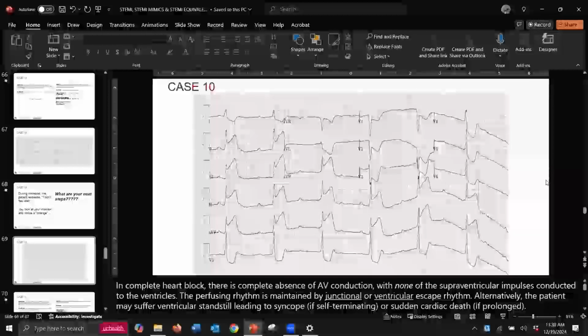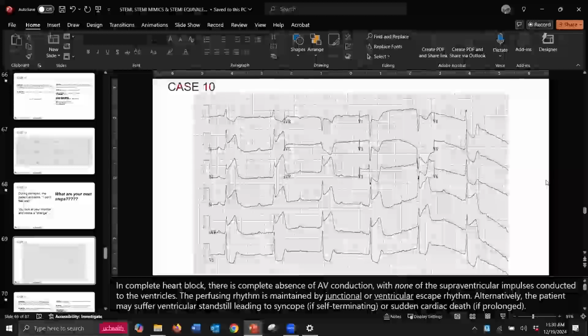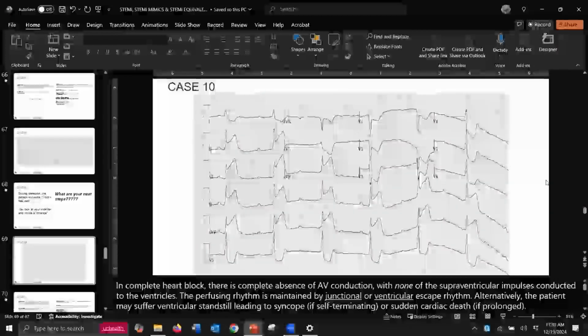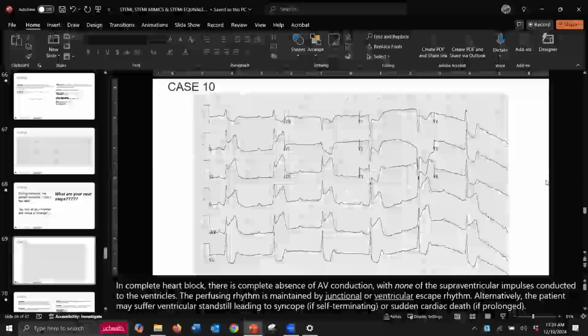Because then when this comes, you can go, oh, damn it, grandma, you shouldn't have done that. Now you're going to get Edison therapy. But here's some Versed, because I'm a nice guy and it's going to hurt. Or fentanyl. Let's just do both. Is she extending her MI in front of your face? Absolutely. And this is a real concern with posterior MIs.